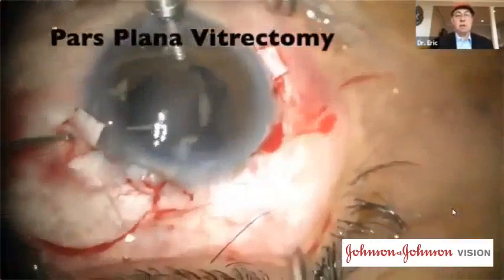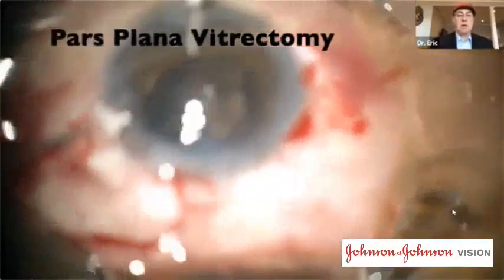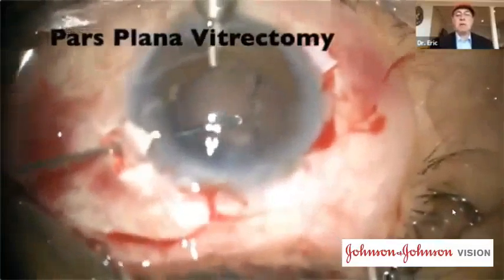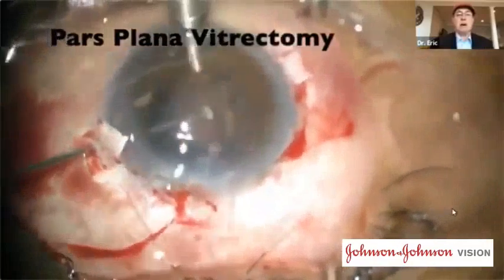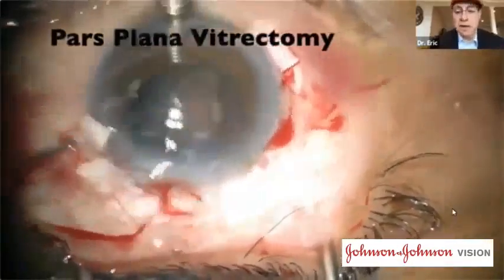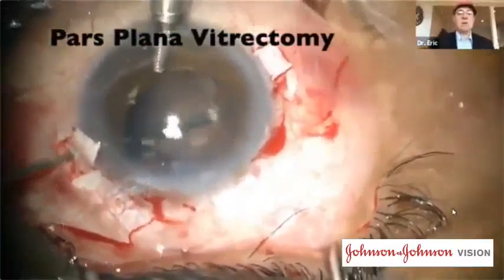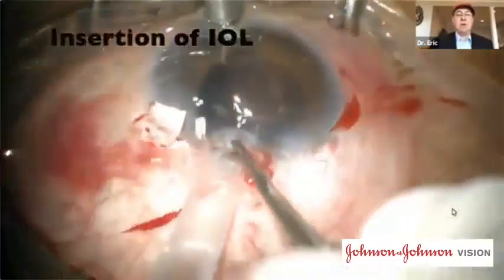Now I do my pars plana vitrectomy. It's very important to remove vitreous. This is done with a gentle aspiration to remove vitreous from the front of the eye in a very controlled environment, well within the realm of almost any good anterior segment surgeon. And then following the removal of the vitreous, we place the IOL.